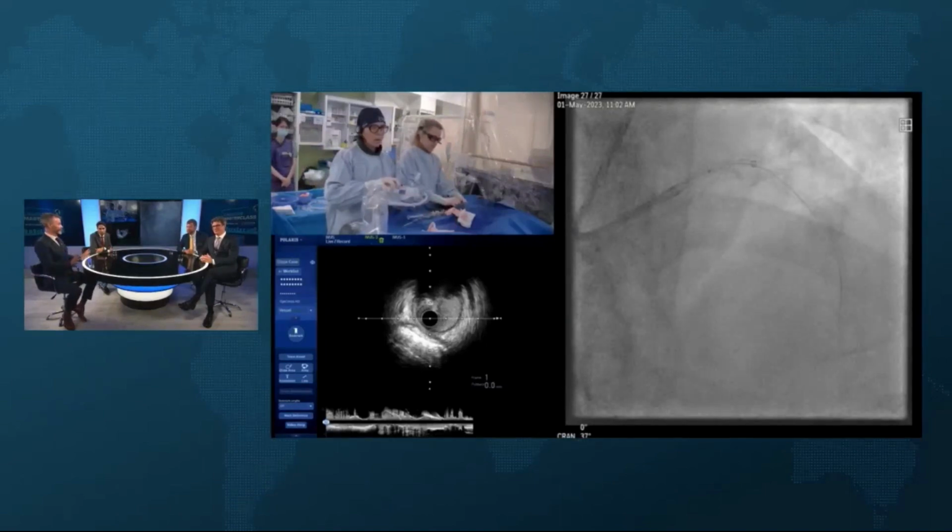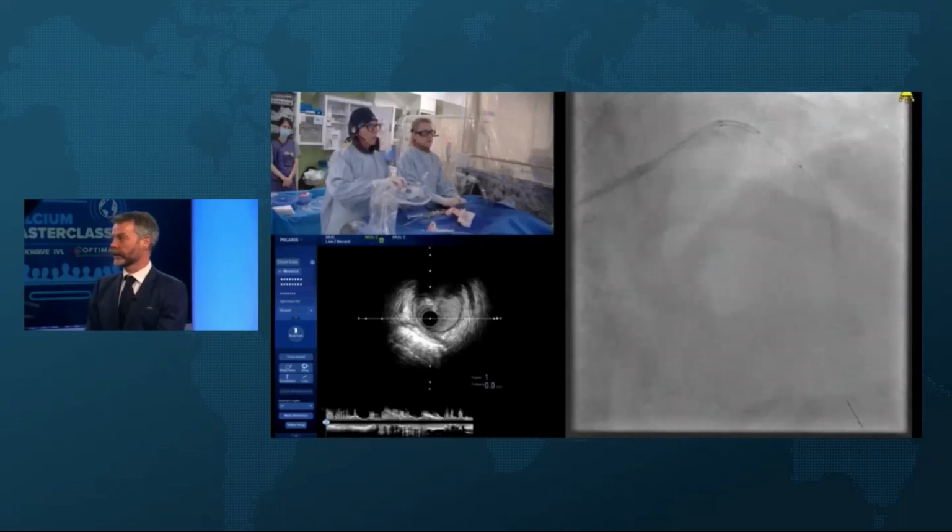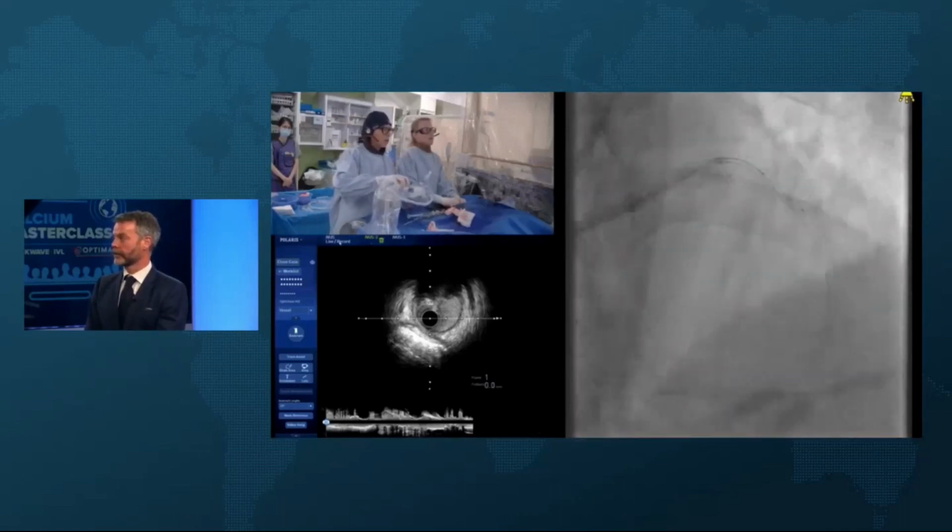We know the stent's going to go to that size, and maybe it's not required, but it does give you that reassurance. It's all the way down.